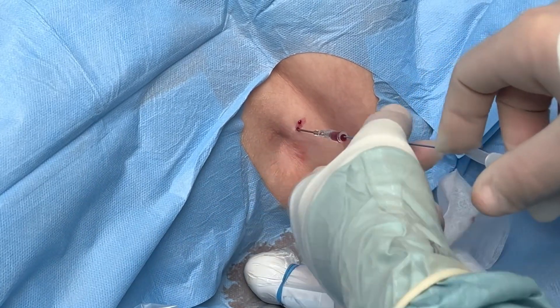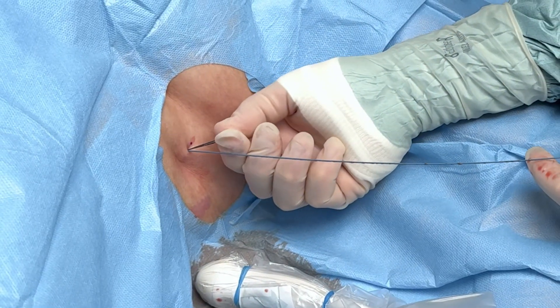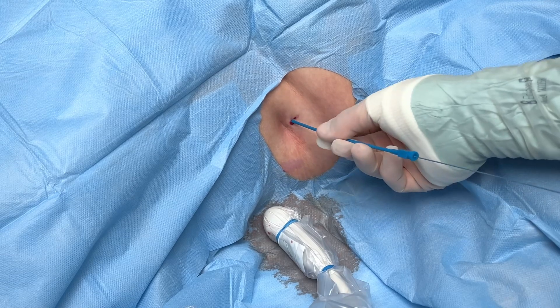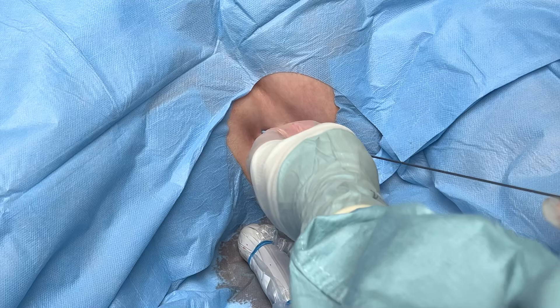At this point, inform the patient that there may be some minor discomfort. This is a critical safety advantage of this technique. We confirm that the guide wire is not in the abdomen, not in the lung, and not extra-thoracic, before potentially causing more extensive damage with the dilator or the drain. Now remove the cannula and use a scalpel to make a very small skin incision. Use an 8 French dilator — it should pass easily as the guide wire is super stiff, which prevents kinking. Insert the drain. Once the tip is inside the thorax, unscrew the lock and slide the drain in without advancing the stiffener further.